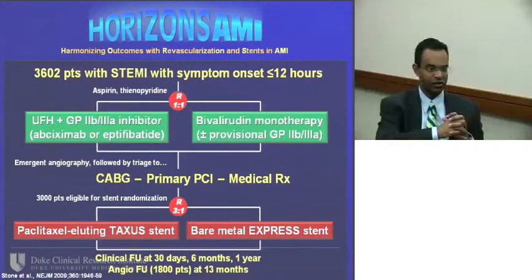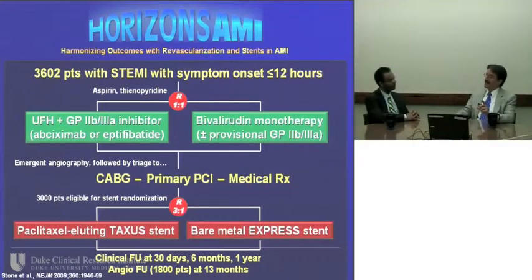Amazing, though. If you look at those numbers, the rate compared with drug-eluting stents in the diabetic versus the non-diabetic is still about 1.5 times to 2 times higher, isn't it? It's still a problem. Absolutely, and again, this is, as you said, a multifactorial issue. There's nothing we're doing with a small piece of steel coated with a drug or bare that's taking on the underlying genetic and metabolic substrate. That's a different area of lifestyle and drug therapies.